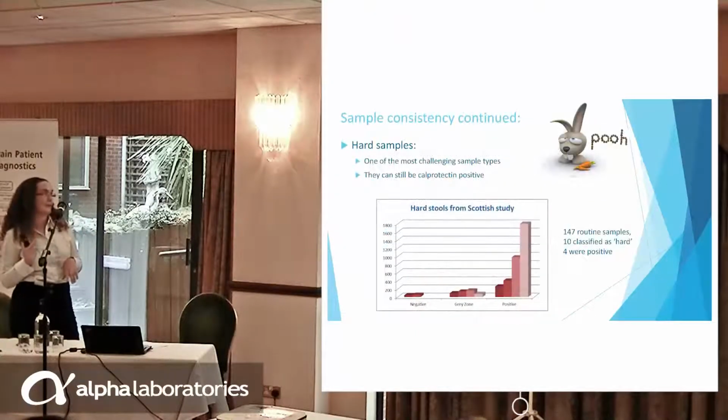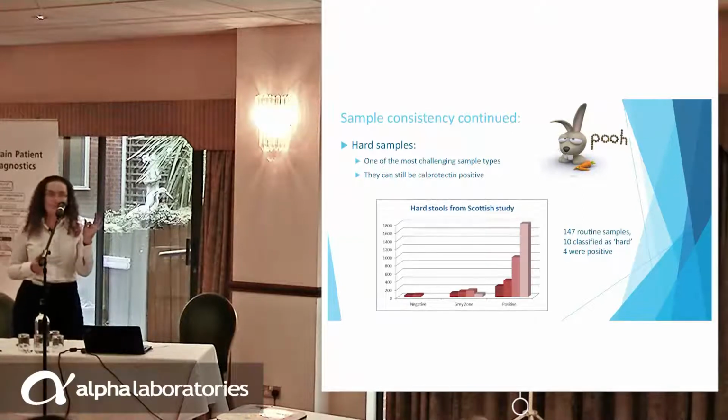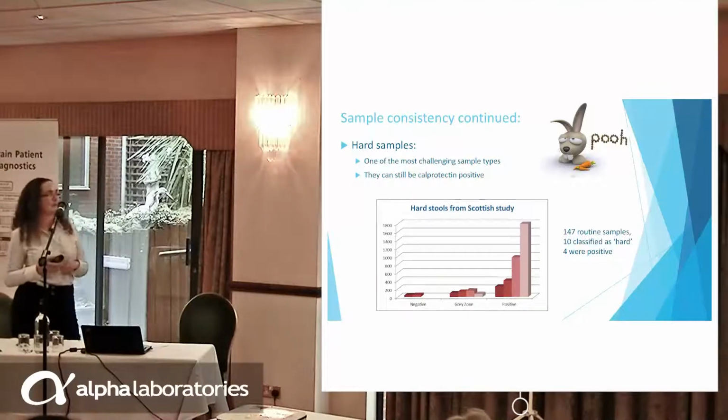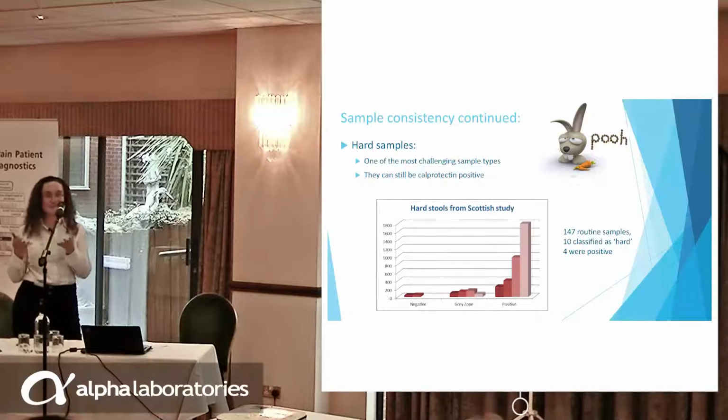The hard samples. We've all seen it. Clinical symptoms say they've had diarrhea for 4 weeks and the only thing they managed to produce for you are these hard little bullets that look like rabbit droppings. These are some of the more challenging types of stool to actually deal with from your perspective, because A, you have to mix them, well yeah, try that one, or weigh them out.